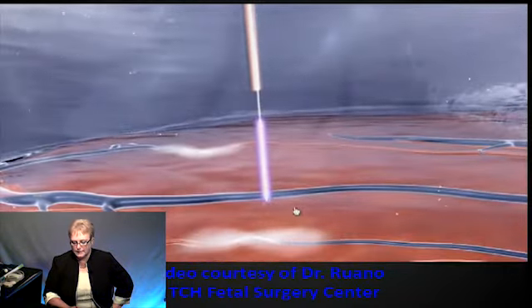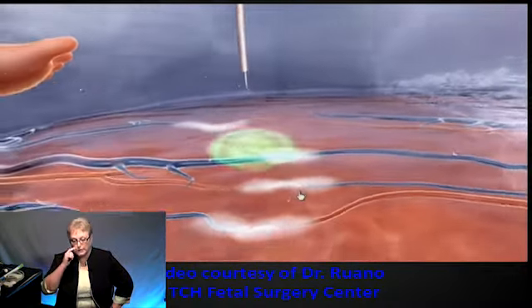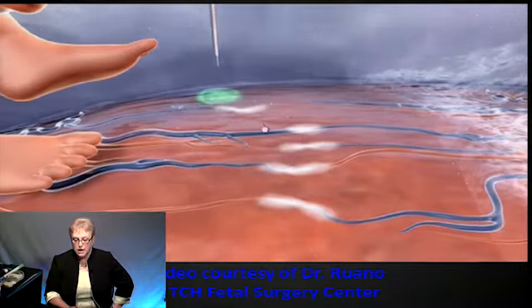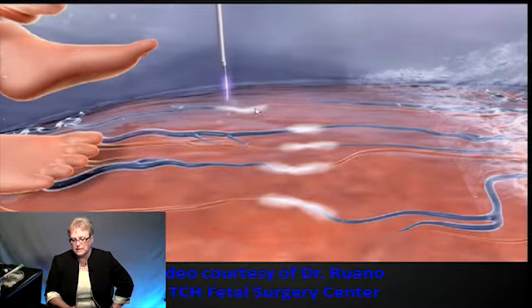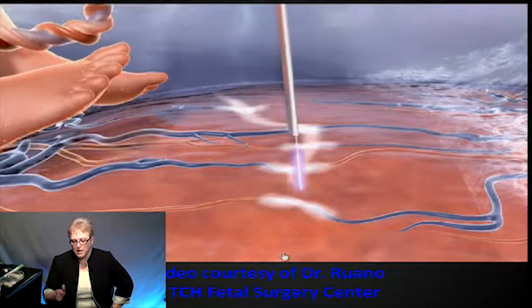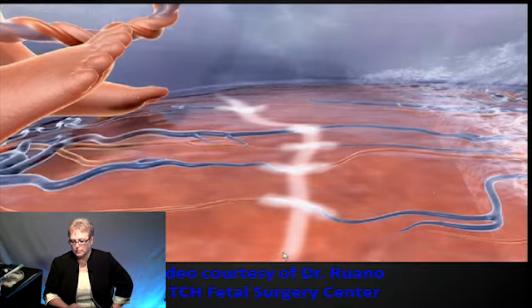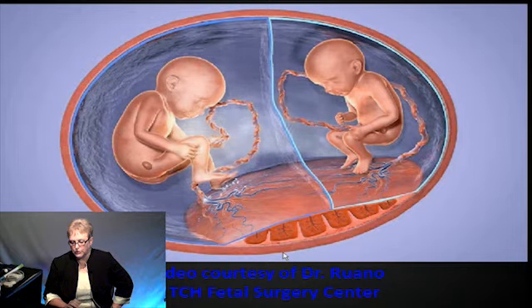And he's going to come back and zap this big one too. We used to leave those alone, but then we were having a recurrence of the twin-to-twin. And now they're going to come back, and it's like connecting the dots. So trying to make an equator between those babies, trying to separate that circulation.